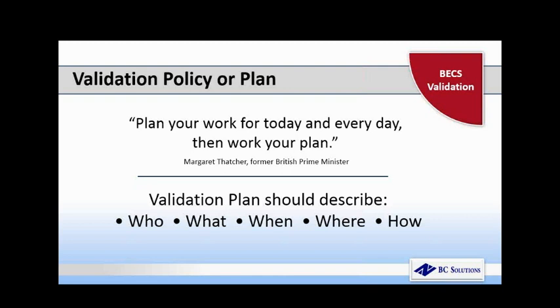Margaret Thatcher once said, plan your work for today and every day, then work your plan. And that's what this validation policy or plan should do. You should be able to plan it out in advance and then follow through on it to create your validation documentation. The validation plan should answer at least each one of the following questions: the who, what, when, where, and how of validation. So let's look at a few of these in a little more detail.